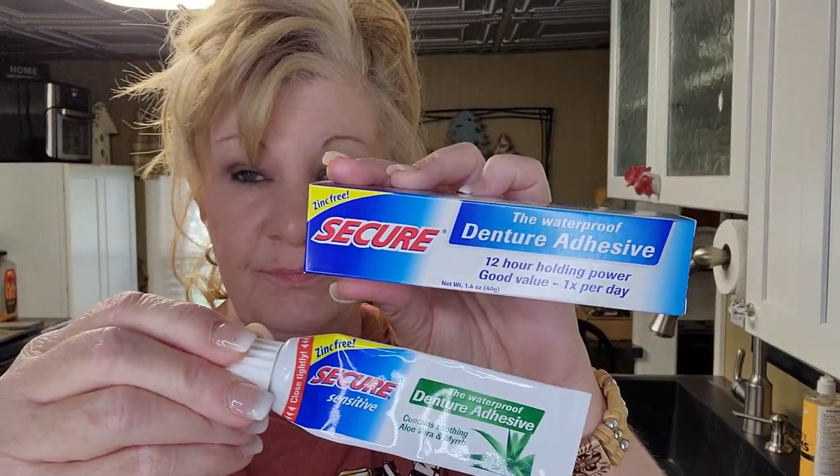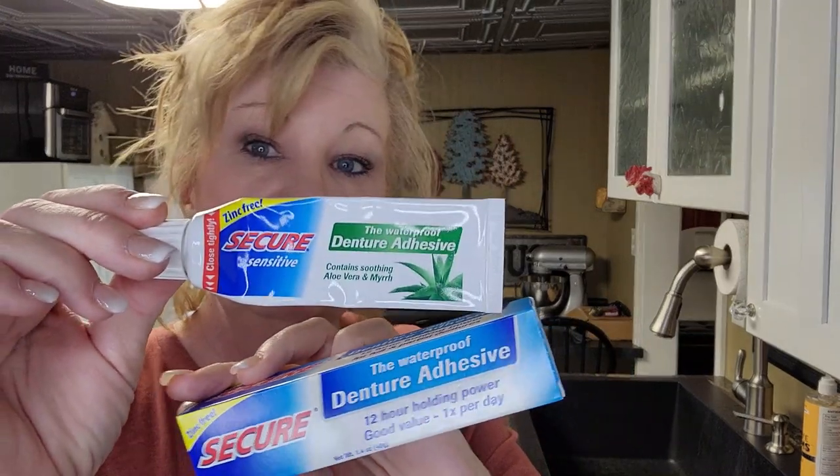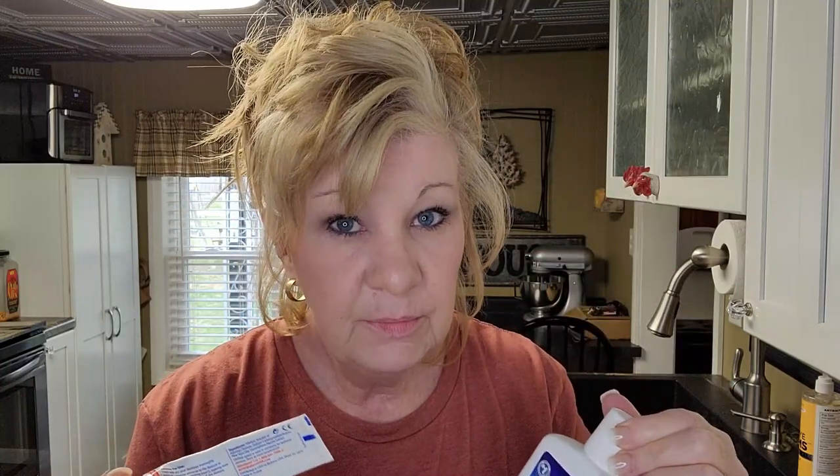I would stay away from adhesives with red dye for now. What I do like is Secure with aloe, and then there's regular Secure — these hold great, they're my favorites. I also like the one with aloe vera; they both hold fantastically. Fixodent powder is great over top of any adhesive on the bottom denture — it holds longer. Put adhesive in, then powder on top, pop it in your mouth, and it should last all day.